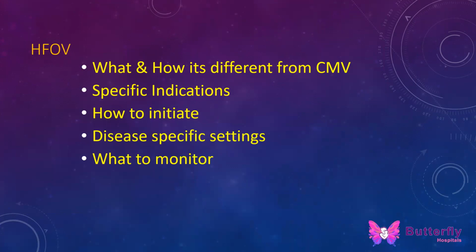One of the main worries we all have as clinicians is trauma to the lungs because of excessive pressure or excessive volume for these very tiny, premature or newborn lungs. So the whole idea is, if any baby needs more pressure or more volume to achieve adequate ventilation or adequate oxygenation.